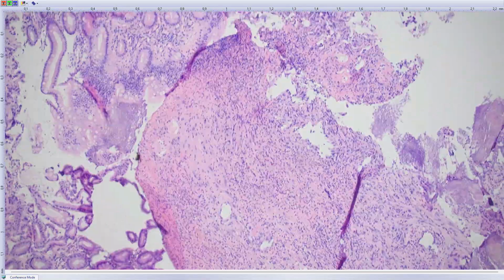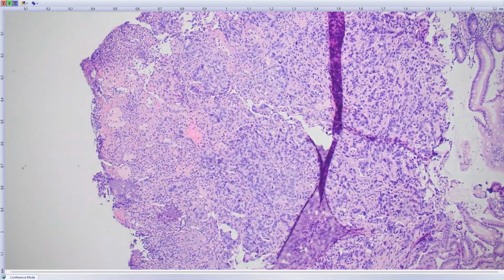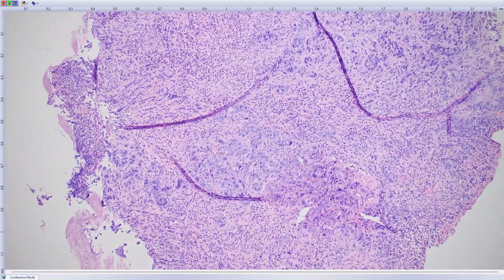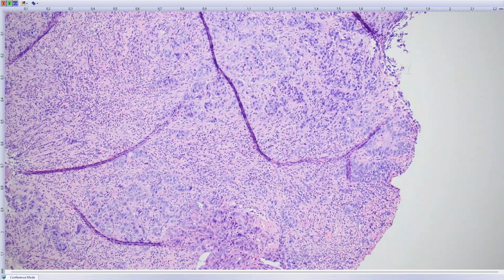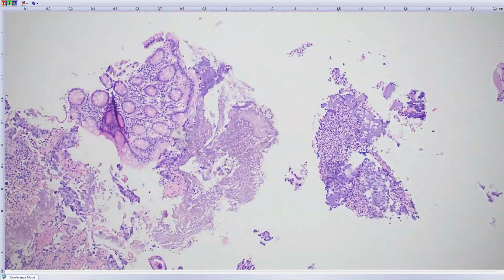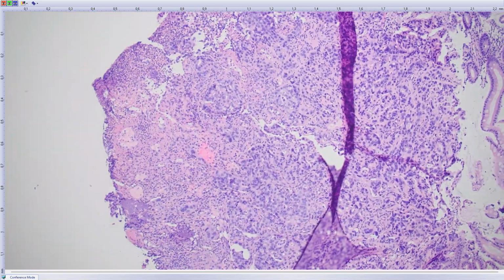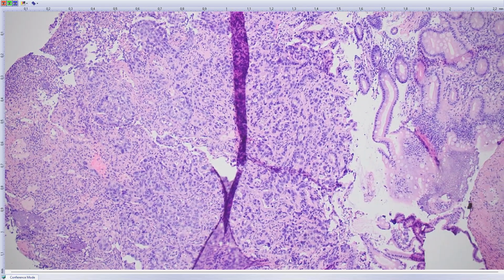So the first impression, the logical process, would be that this is a primary colonic adenocarcinoma metastasizing to the liver, which is a very frequent situation. It was proved many times that metastatic tumor also exists in cirrhotic liver. There was a presumption for many years that once you have a cirrhotic liver, the only chance to have a tumor is a primary tumor, because of portal hypertension and the pressure gradient there is no option for tumors to metastasize in, but it is not true anymore.